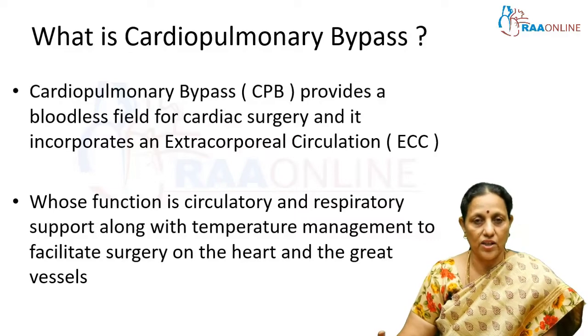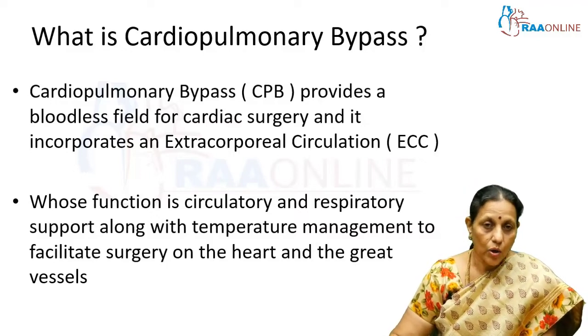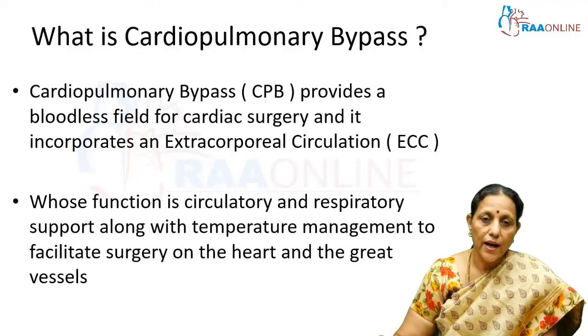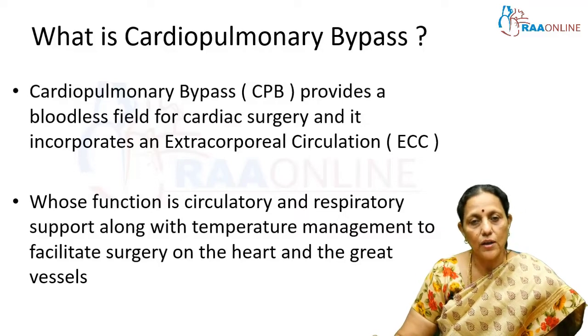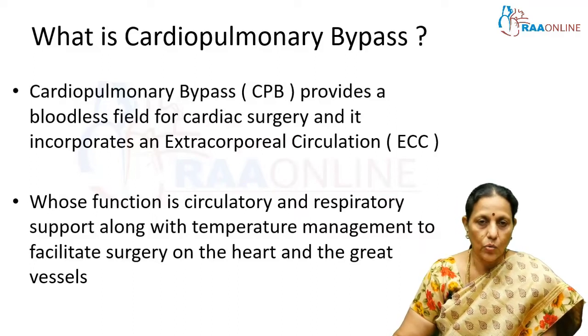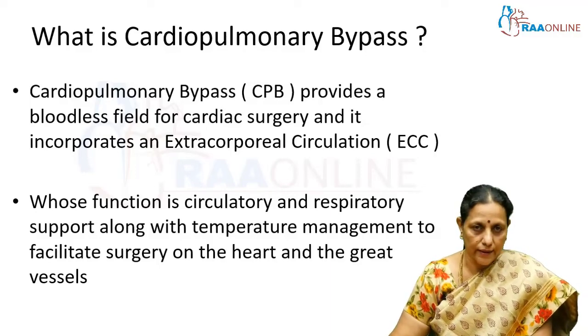That is the initiation, how the bypass procedure starts very slowly and gently, and how we conduct a smooth bypass run, taking into consideration the metabolic and the physiological aspects of the blood. And of course, after the surgery is over, how we come off bypass, that is how we disconnect the connection between the patient and the heart-lung machine. So now we would be going into the details.